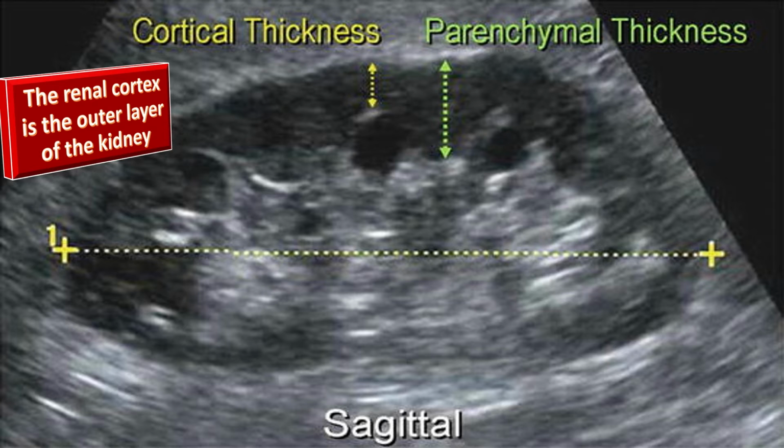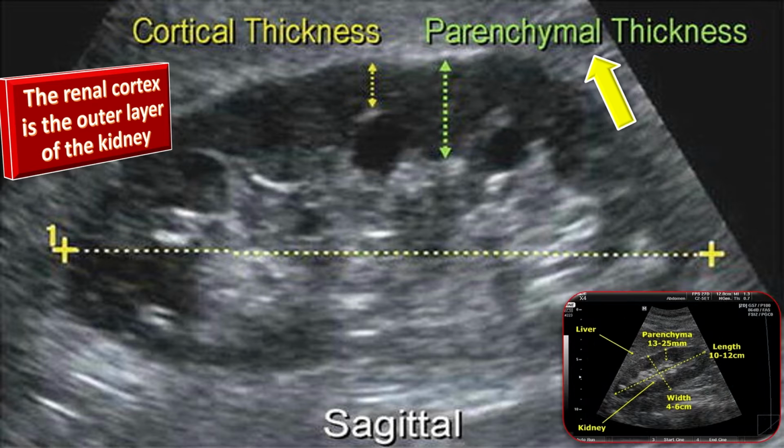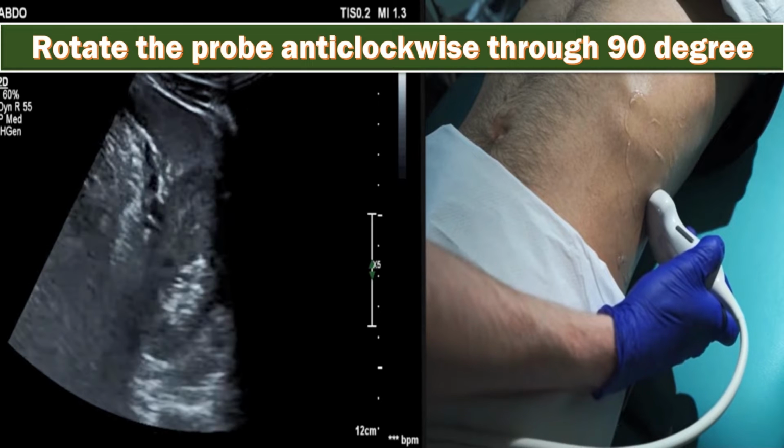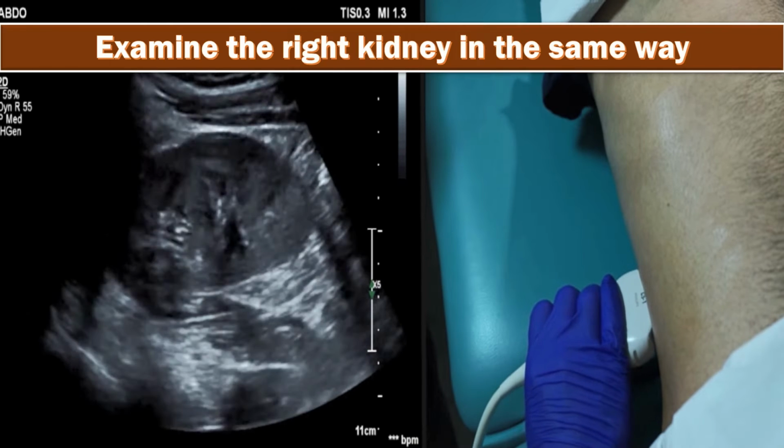Renal parenchyma appears as a relatively homogeneous structure with variable echogenicity, or brightness, compared to other abdominal organs. Its thickness is approximately 13 to 25 mm. The length of the kidney is about 10 to 12 centimeters and the width is about 4 to 6 centimeters. Rotate the probe anti-clockwise through 90 degrees. Examine the right kidney in the same way.